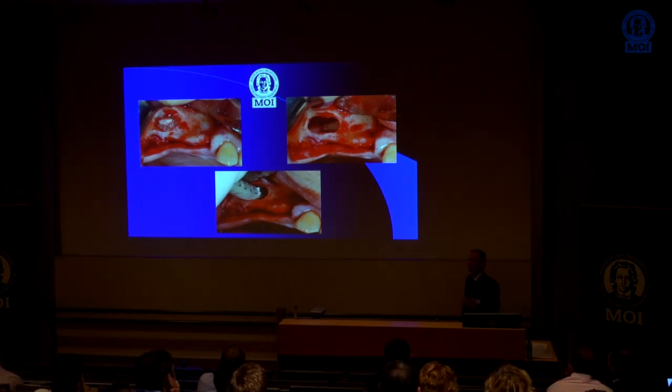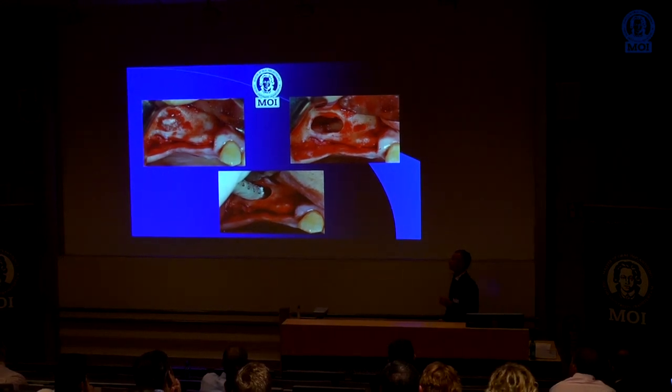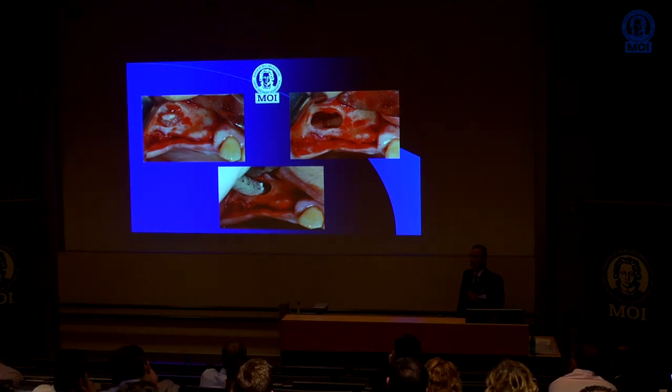which was later modified by other American doctors, and which is nowadays known as the sinus augmentation procedure. It basically consists of raising a full-thickness flap in the posterior maxilla in order to expose the lateral wall of the sinus, making a round or oval-shaped osteotomy just to remove the cortical bone in order to get access to the sinus membrane, and carefully detaching the sinus membrane from the underlying bone with a set of specifically designed curettes, just to create a subantral space by lifting the sinus membrane upward in an attempt to reestablish the floor of the sinus in an anatomical position that resembles pretty much the one it had when teeth were present.